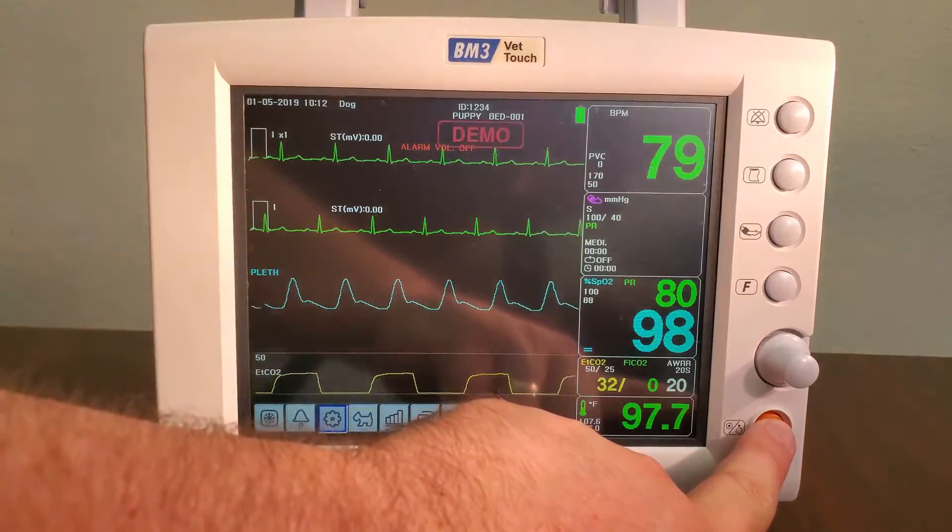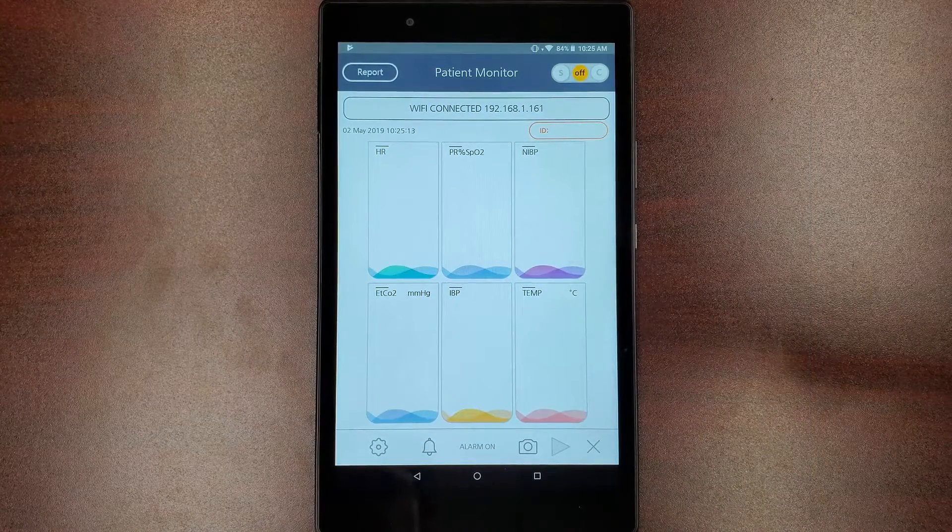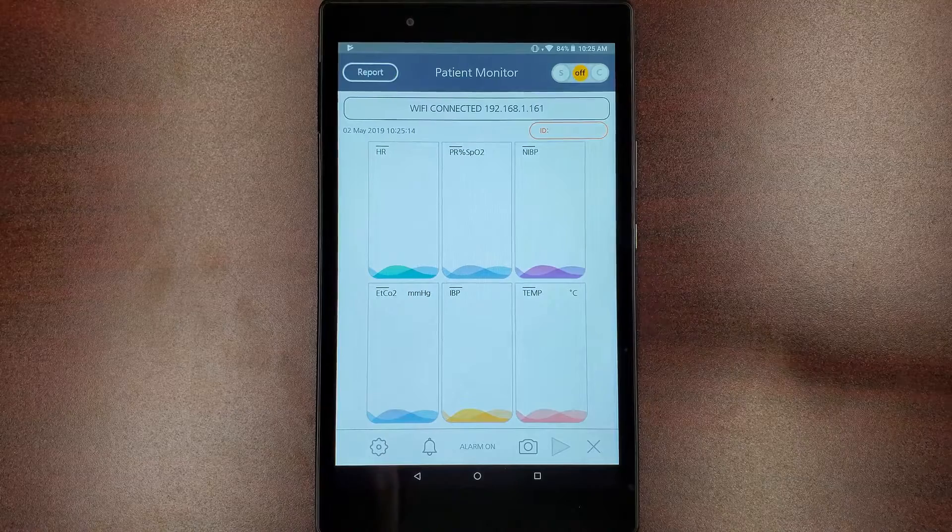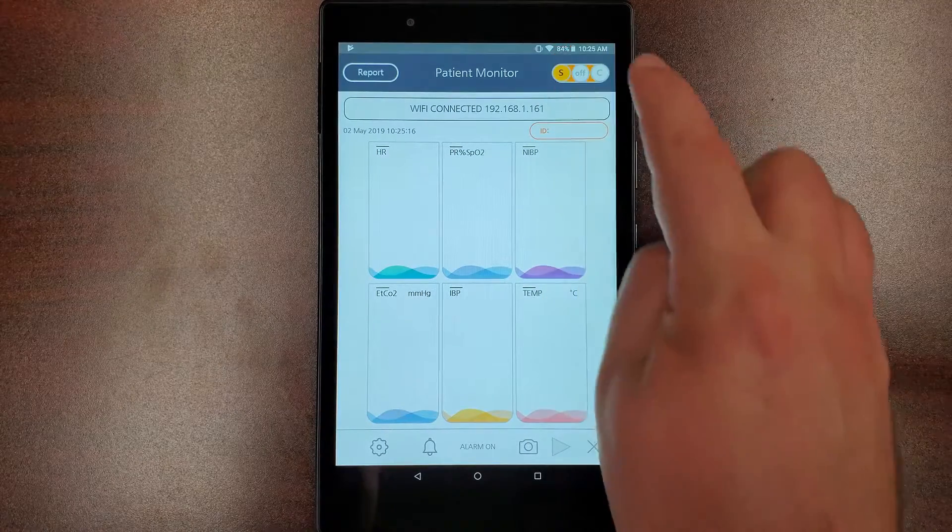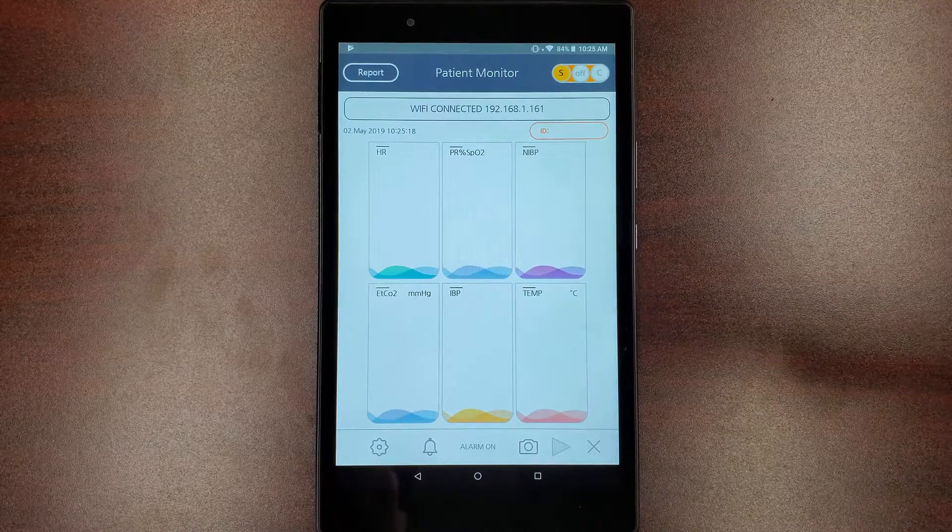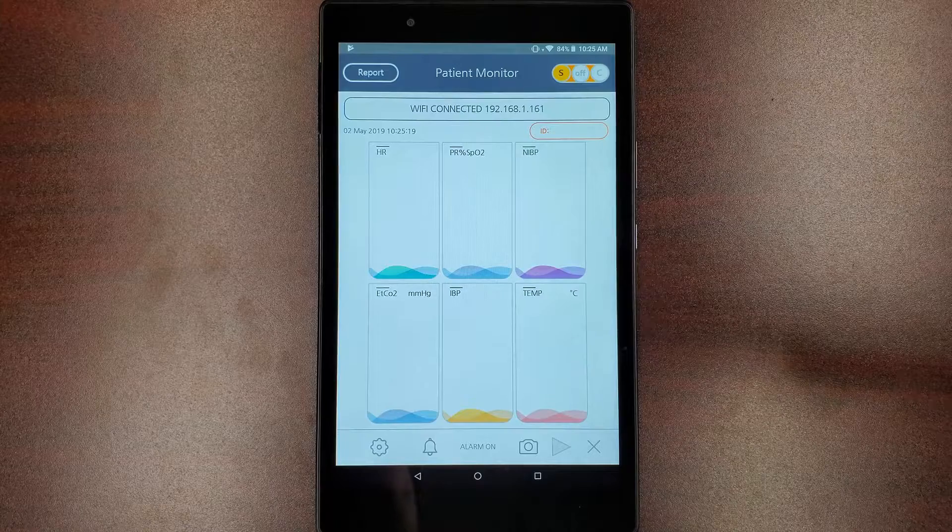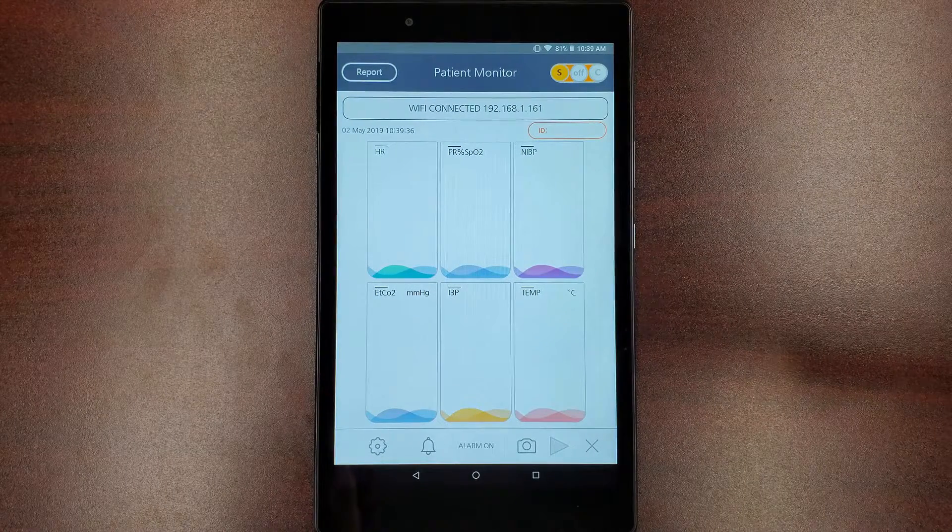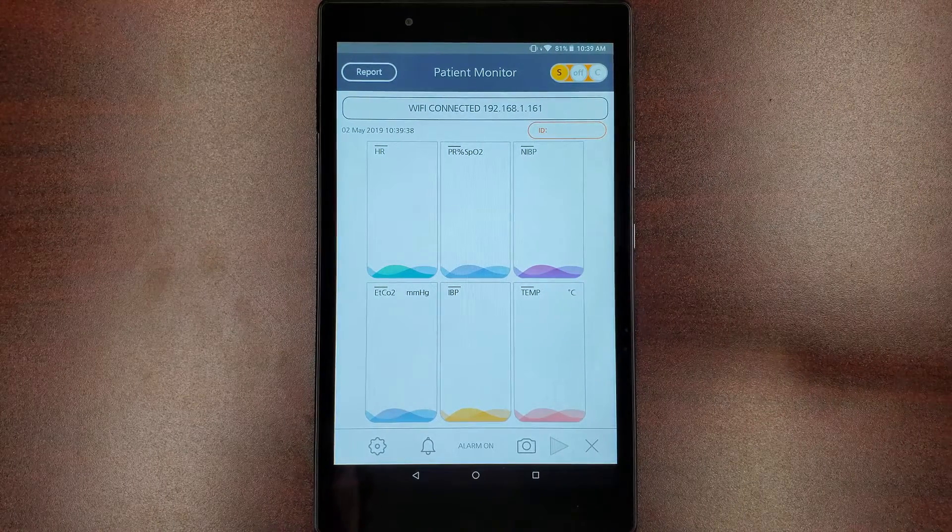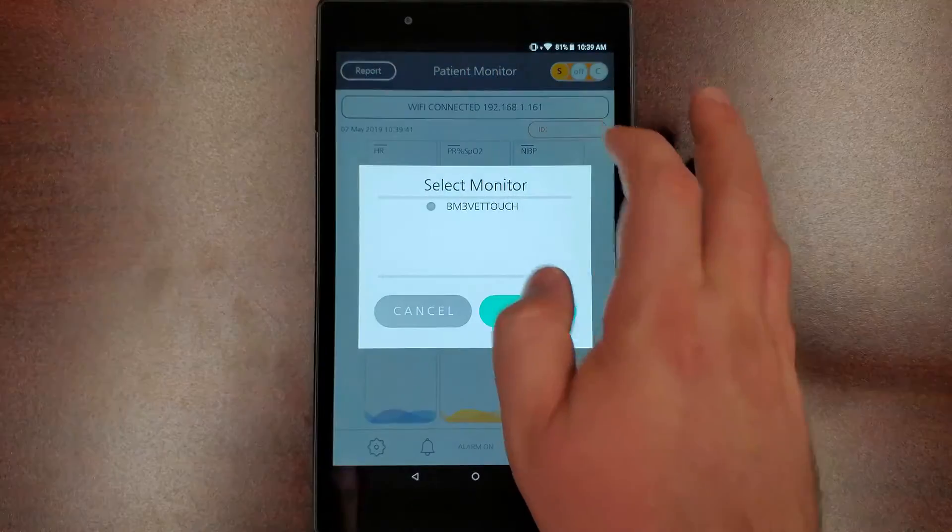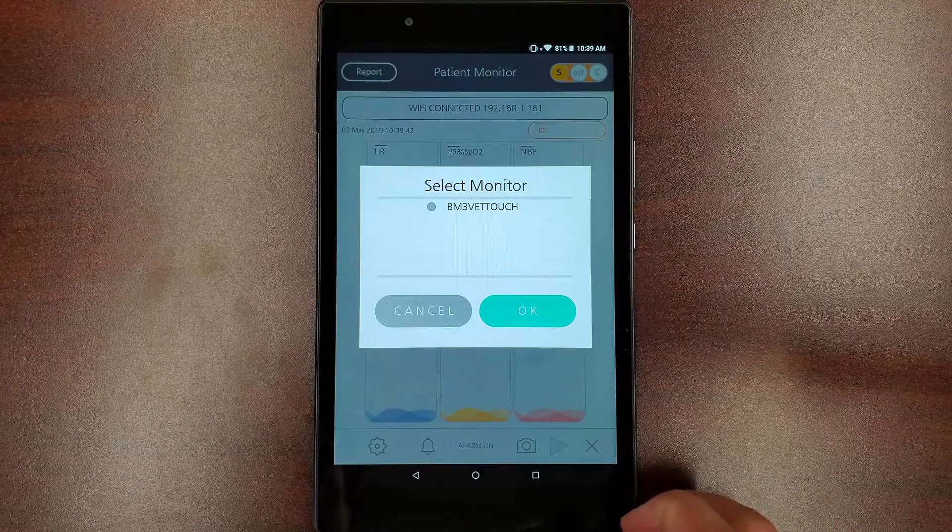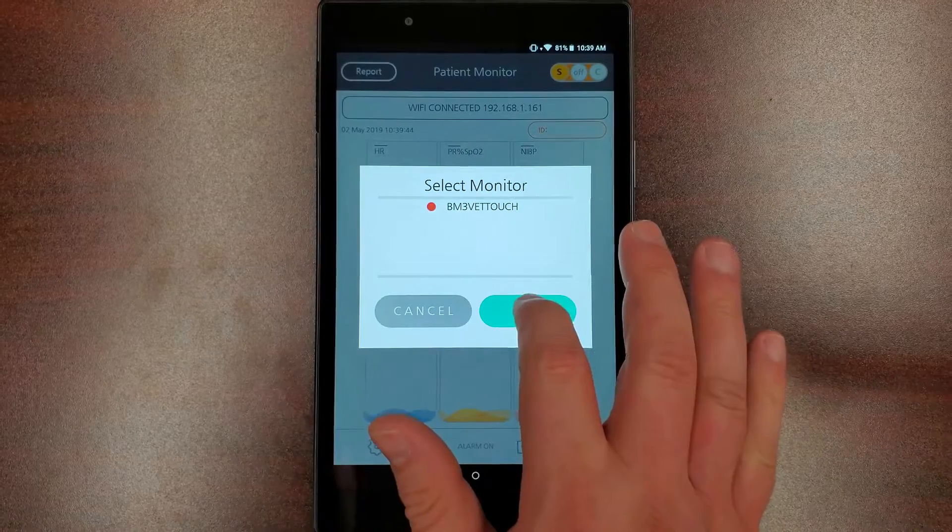Now that you have uploaded the IP address in your patient monitor, tap on the S in the top right corner to turn on server mode. After roughly 10 to 20 seconds, tap the ID field beneath your IP address and your monitor should be listed. Hit OK to connect and the patient data from the monitor should show on the screen.